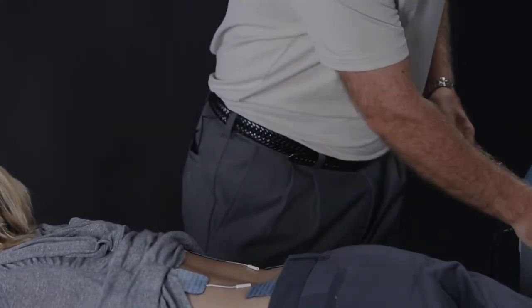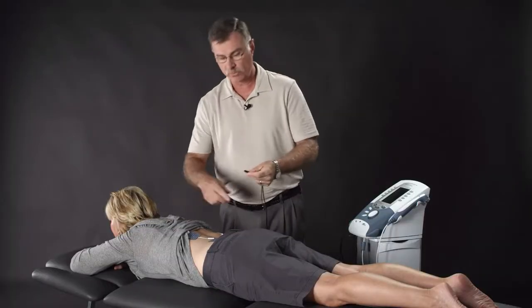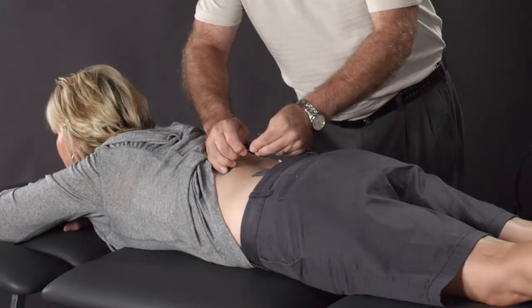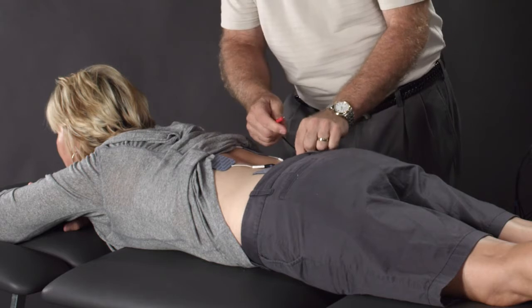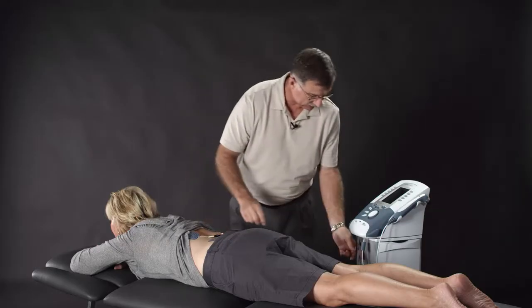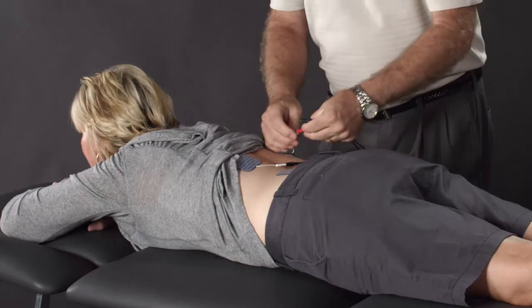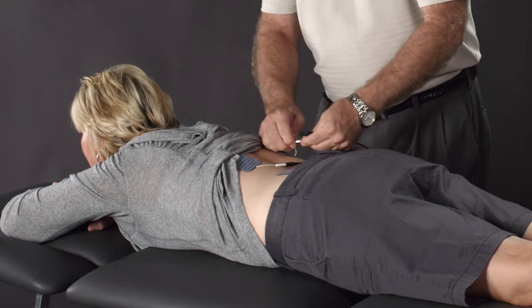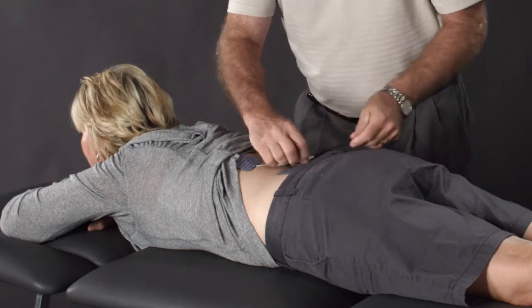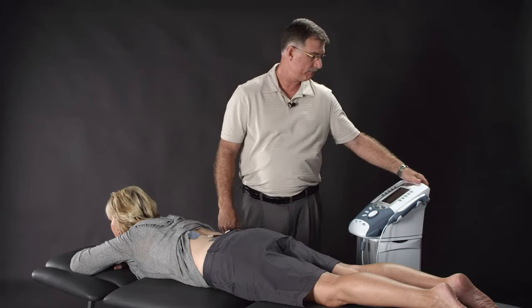The next thing we'll need to do is plug up the lead wires. And again, as we use the channels, we want to make sure we cross them. So we'll take one channel, and then we will take the second channel, again so that the two channels are crossing. Now, let's turn the machine on and get started.